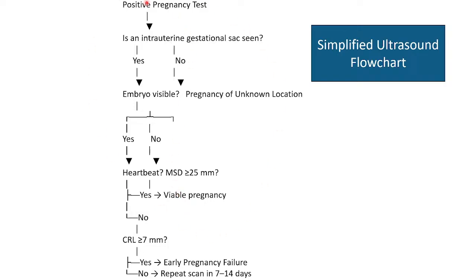If you master this flowchart, it will be very easy for you to do the sequence of a first trimester ultrasound scan. You have to follow it like that. If you miss any of these steps, guys, you are going to make a very dangerous assumption. Doing an obstetric scan sounds like something very easy. I've checked the uterus, there's nothing inside. I sent the patient away, there's nothing. Or I saw the patient, it's a missed abortion, or it's a blighted ovum.